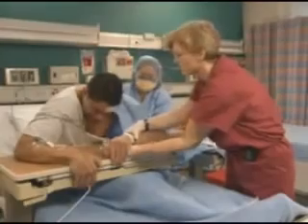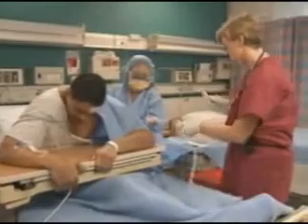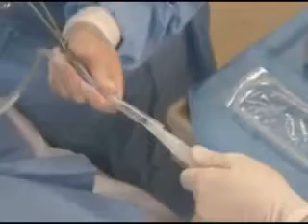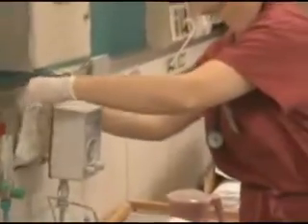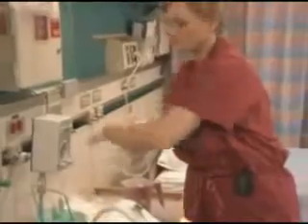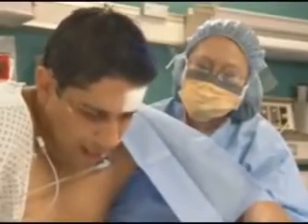After the chest tube is in place, help the physician connect it to the drainage tube on the closed chest drainage system, keeping the connector sterile. As ordered, set up wet suction, dry suction, or gravity drainage. The type used depends on how much air must be removed and how quickly the pneumothorax must be resolved.